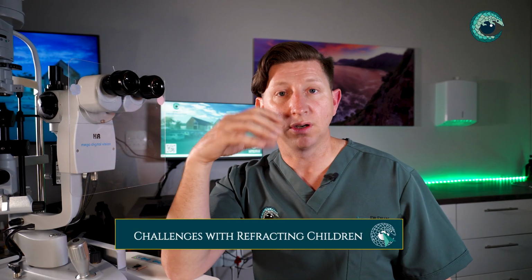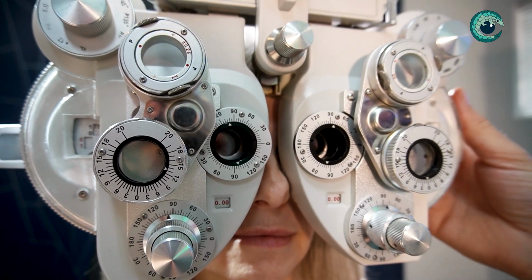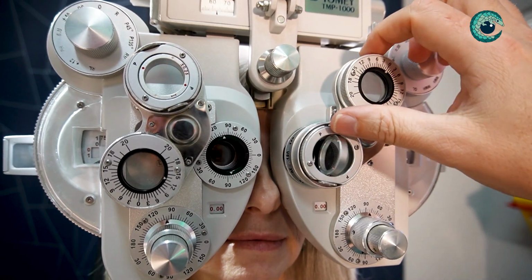So cycloplegic refraction is used in a variety of contexts, but normally in the context of children. Children aren't easy to refract. If you put a child in a phoropter, a phoropter is the machine where we put lenses in front of the eye and change the lenses and ask you what is better, one or two, and get responses from you to help guide us as to what lenses and what glasses script you need.